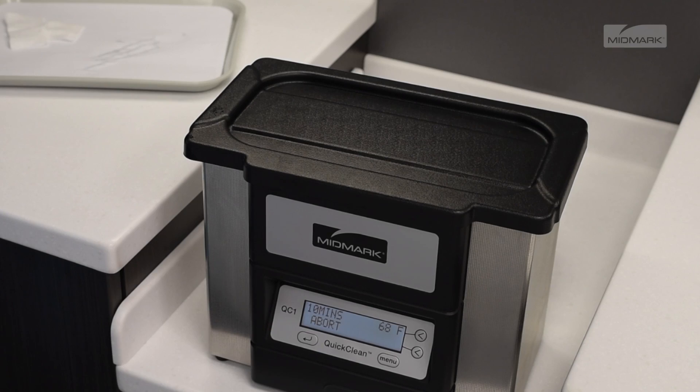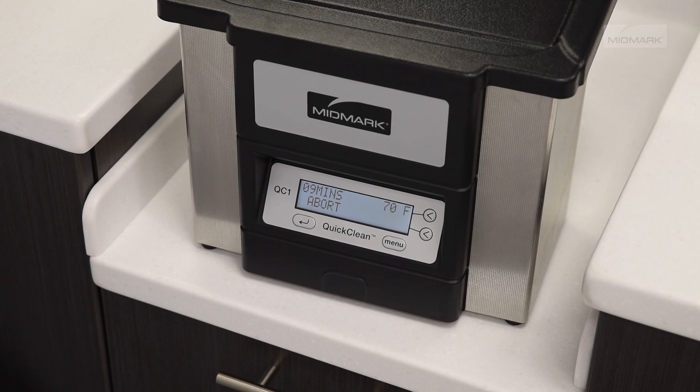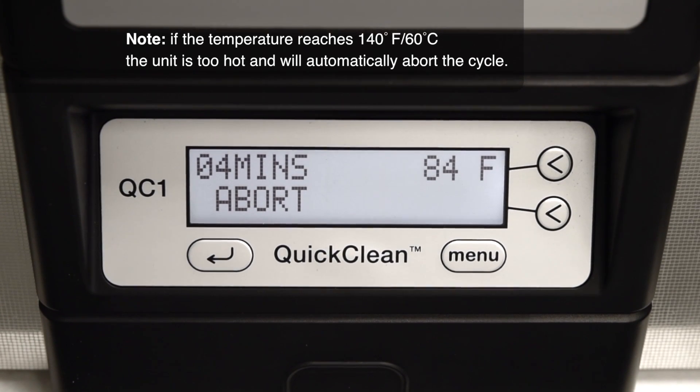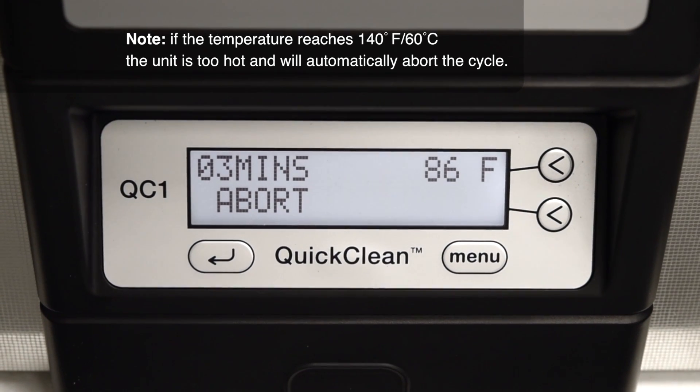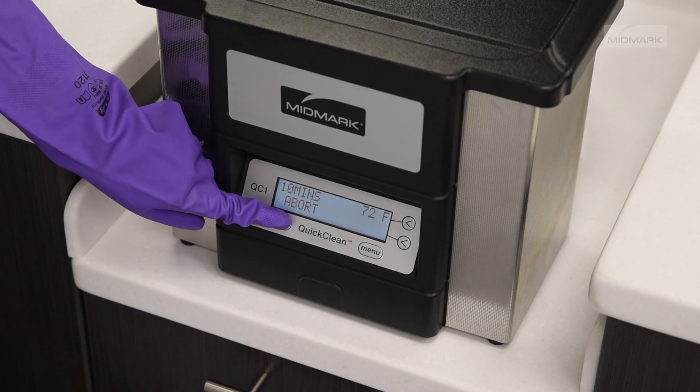When the Quick Clean is in operation, the following screen will display reflecting the time remaining in the cycle and the liquid temperature. The time will count down in one minute increments. The temperature will increase with use. The operator can abort or stop a cycle at any time by pressing the abort key.